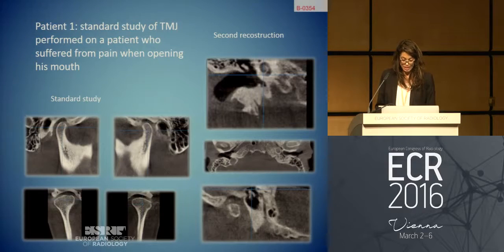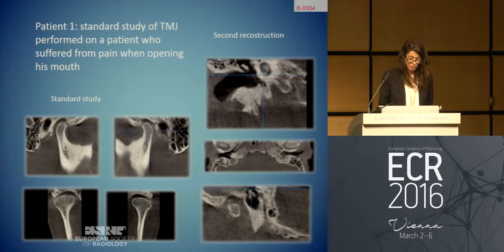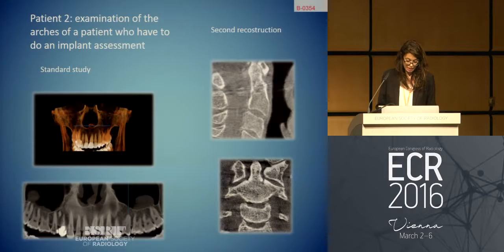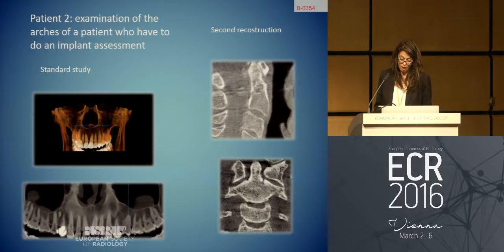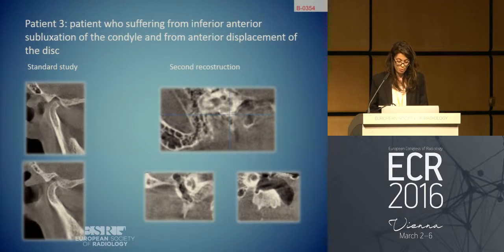For example, this is the result of a standard study of the temporomandibular joints performed on a patient who suffered from pain when opening his mouth. After sagittal and coronal reconstructions of the temporomandibular joints, we tried to reconstruct the temporal bone using the same data. These images, instead, are taken from the examination of the arches of a patient who underwent cone-beam CT for an implant assessment. Following the standard reconstructions, we reconstructed the cervical spine. These are temporomandibular joints reconstructions in a patient suffering from inferior anterior subluxation of the condyle and anterior displacement of the disc, on which we then reconstructed the temporal bone structures.